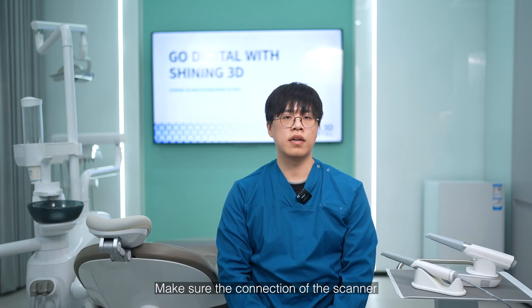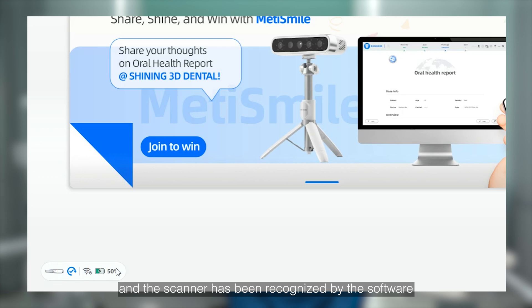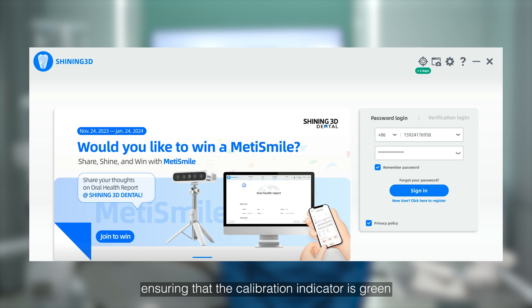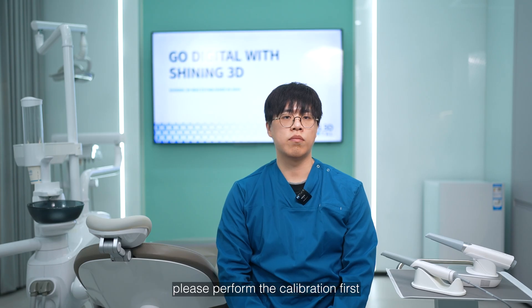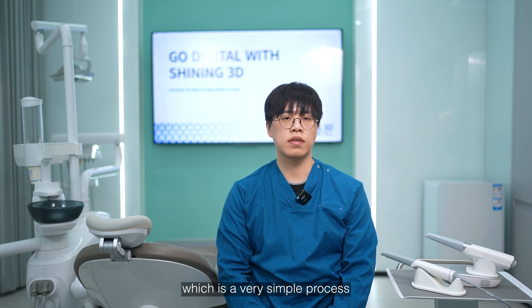Make sure the connection of the scanner, computer, and power cable is correct. The software should be running and the scanner recognized by the software. Check the calibration state, ensuring that the calibration indicator is green. If not, please perform the calibration first. We have a video to demonstrate how to calibrate, which is a very simple process.